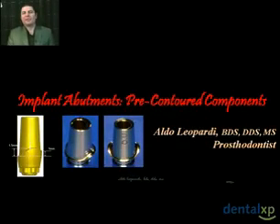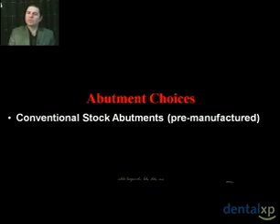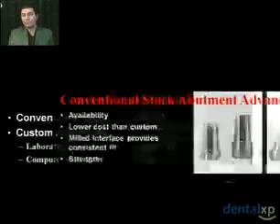My name is Dr. Aldo Leopardi, and it is my pleasure to present to you this topic of implant abutments, pre-contoured components. Up until recently, our abutment choices have been conventional stock abutments, pre-manufactured, and customized abutments. Customized abutments could either be laboratory cast or computer milled.